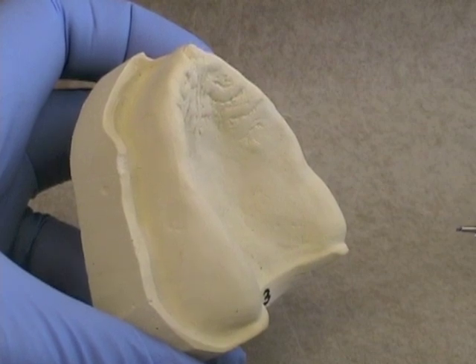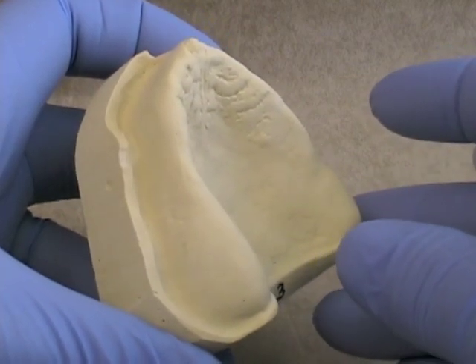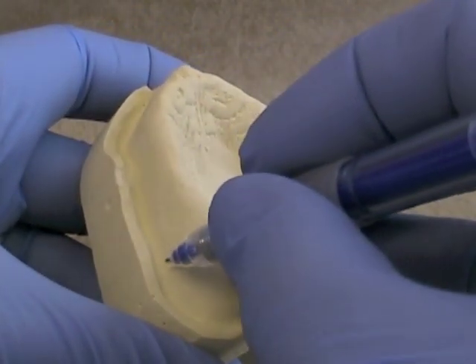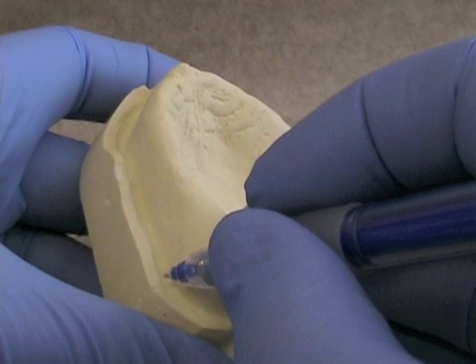When you send your cast to the lab to have a custom tray fabricated, you should outline where you want the tray to end. When you're looking in the vestibule, you want the tray to end about 2 to 3 millimeters from where the height of the vestibule is.